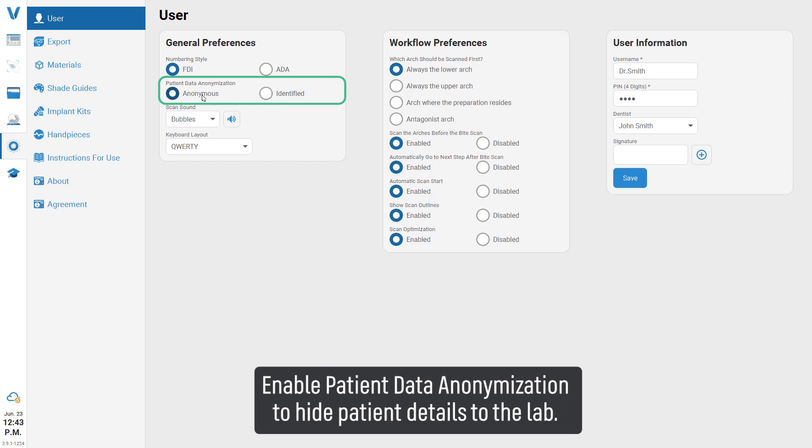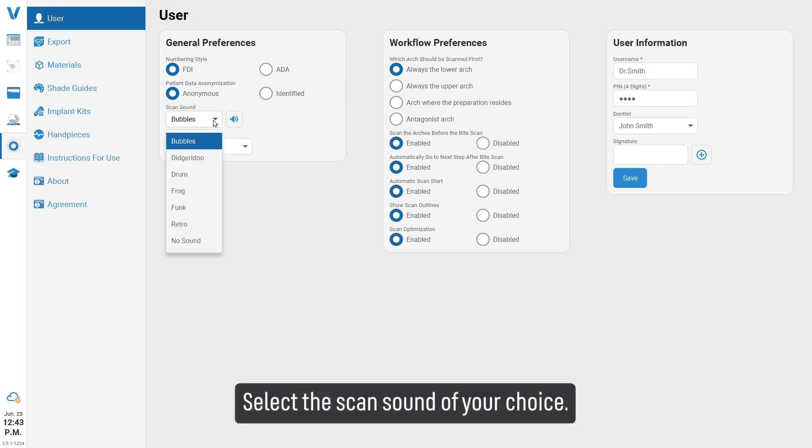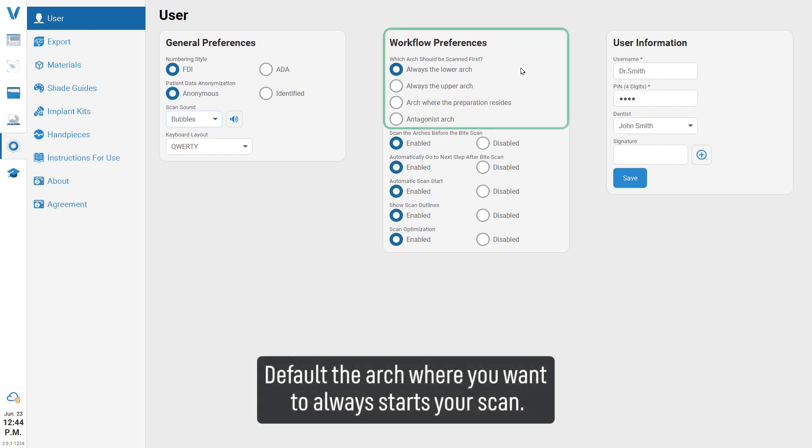Enable patient data anonymization to hide patient details to the lab. Select the scan sound of your choice. Default the arch where you want to always start your scan.